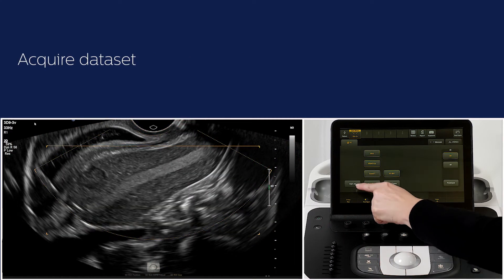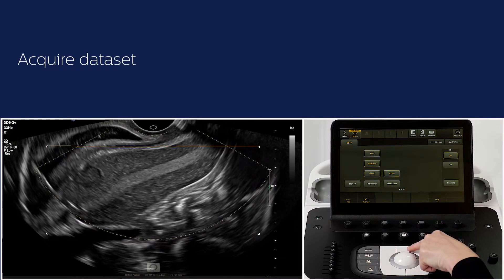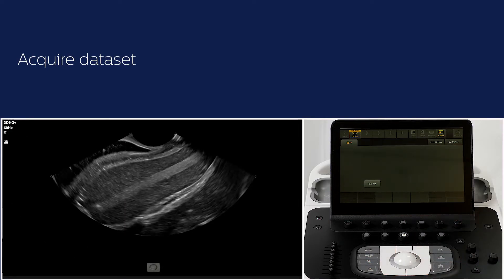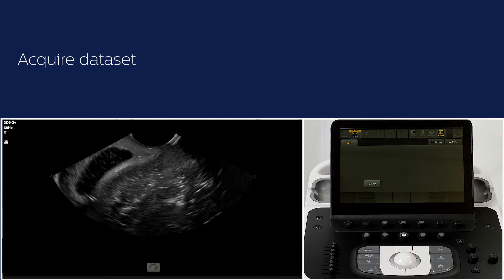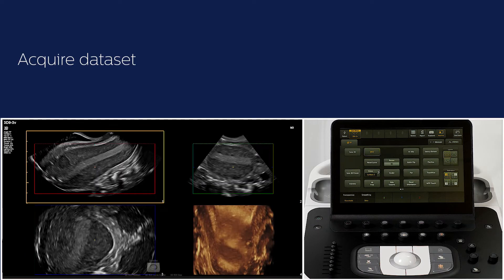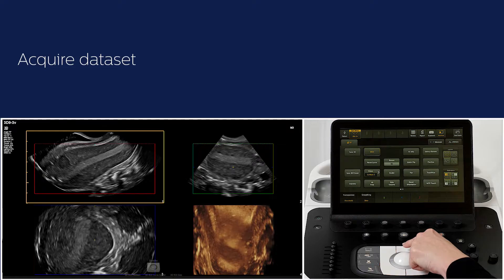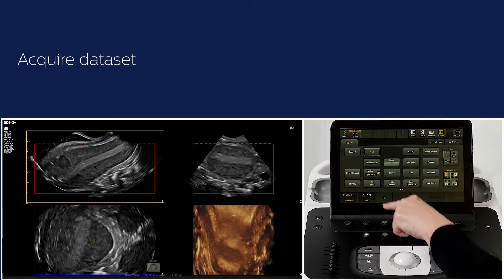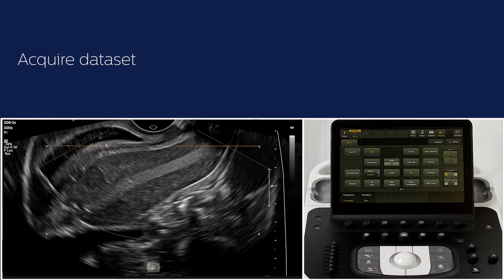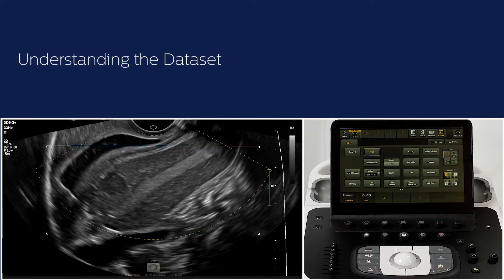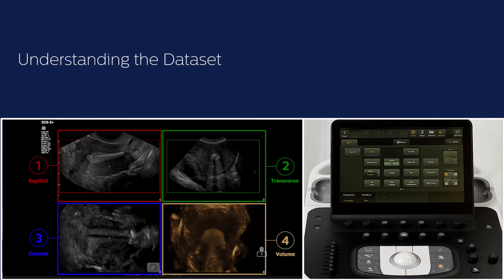Press Start 3D on the touch screen or the middle button above the trackball to start the acquisition. Press Standby on the touch screen or the middle button above the trackball if you want to reacquire the data set. On the monitor, you see the sagittal, transverse and coronal plane of the uterus, as well as the volume image, numbered from 1 to 4.